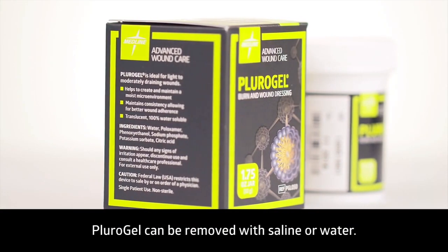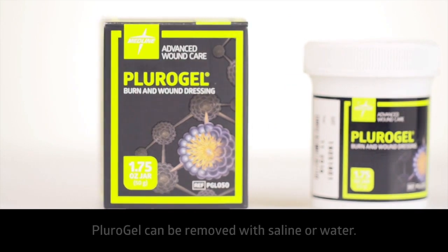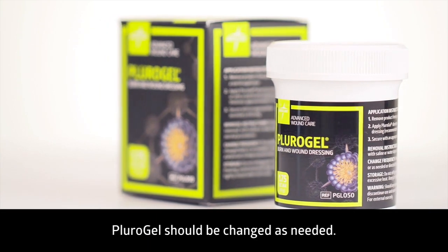Plurigel is water-soluble and can be removed with saline or water depending on normal procedures. Plurigel should be changed as needed to maintain a moist wound healing environment.